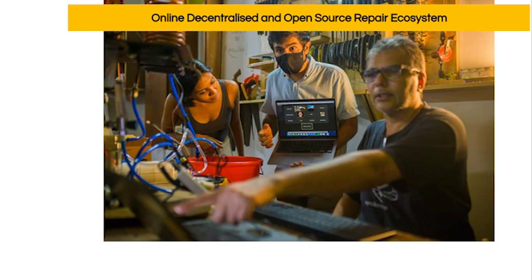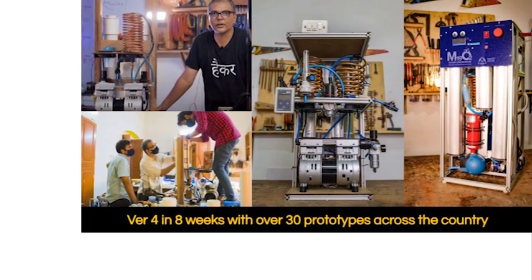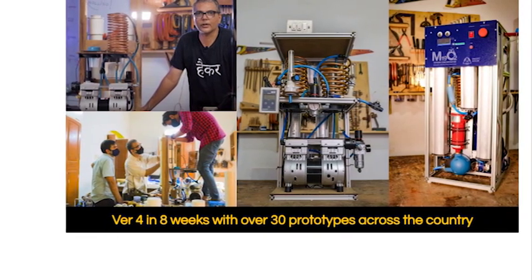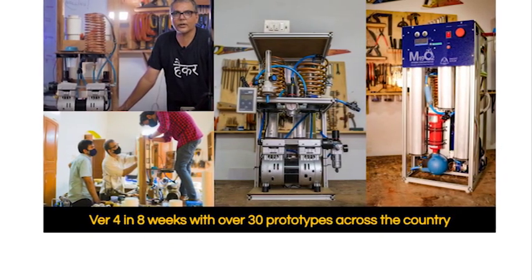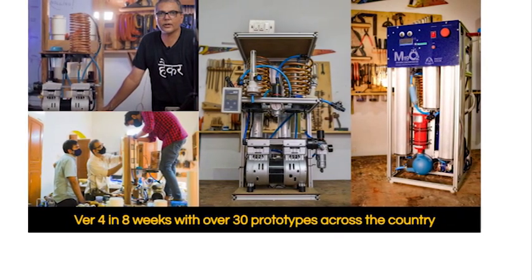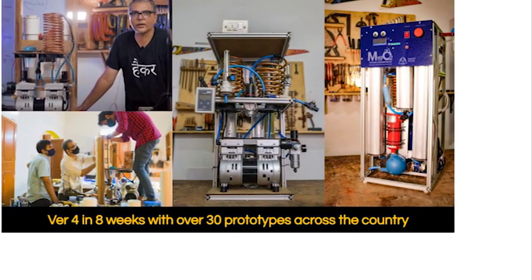In addition, this work will create a framework for quality checks to be established when repairing locally. Collective open innovation and social entrepreneurship is the co-tenant of the M19 initiative. We were able to activate over 150 organizations to work on open research and development to make oxygen concentrators locally in India in April 2021 using locally available materials, and we were able to prototype across 30 locations using the same principles of open sourcing and distributed manufacturing.